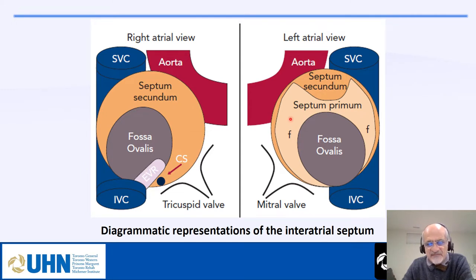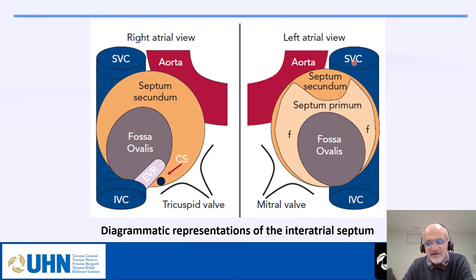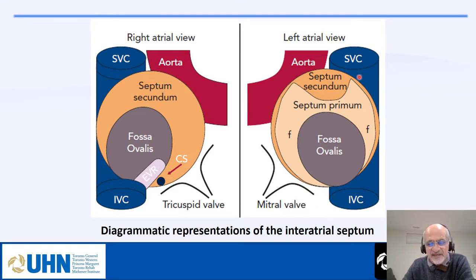This is the interatrial septum from the left side. From the left side you see mainly the septum primum fused with the septum secundum, the fossa ovalis, and a little bit of the septum secundum from the top. In this view, the SVC is around 12 to 1 o'clock, and the right upper pulmonary vein is around 1 o'clock — we use the pulmonary vein as our landmark when showing the interatrial septum from the left side.